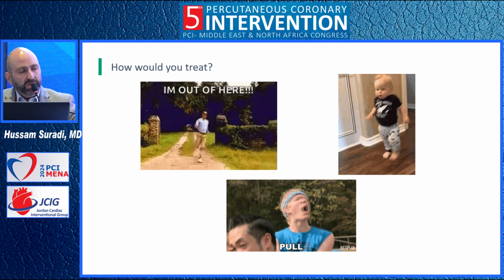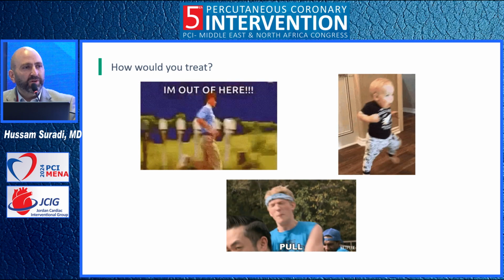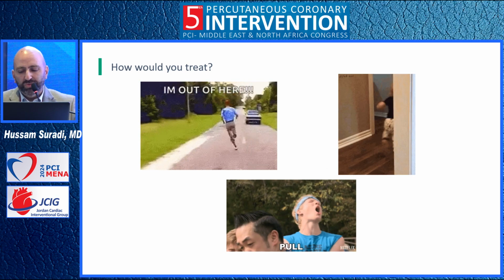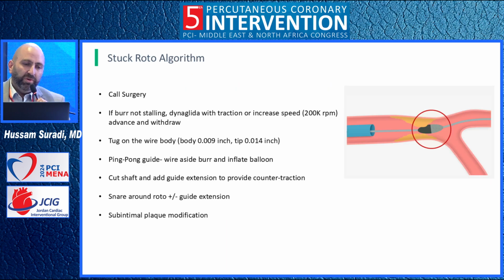And just what Dr. Ahmad Kamel just mentioned, be calm. The worst thing you would do right now is freak out and not know what to do. This is such an infrequent complication that you have to think about the steps of how to handle it. So the first thing you want to have in your mind is you need to call surgery. You need backup surgery. There's a risk of perforation, loss of flow, all of the hemodynamic instability. You have to involve your surgeons in this case.